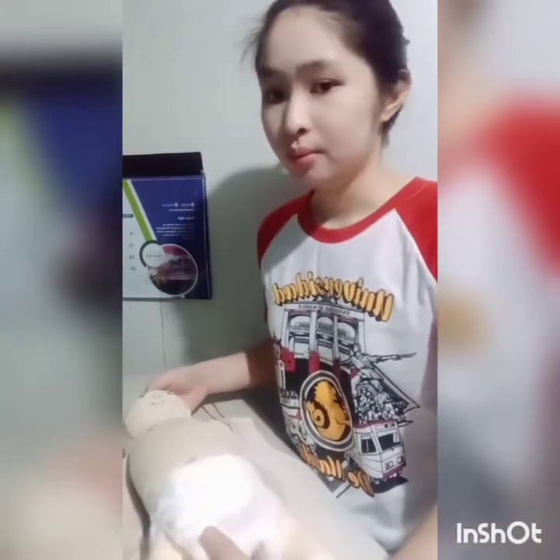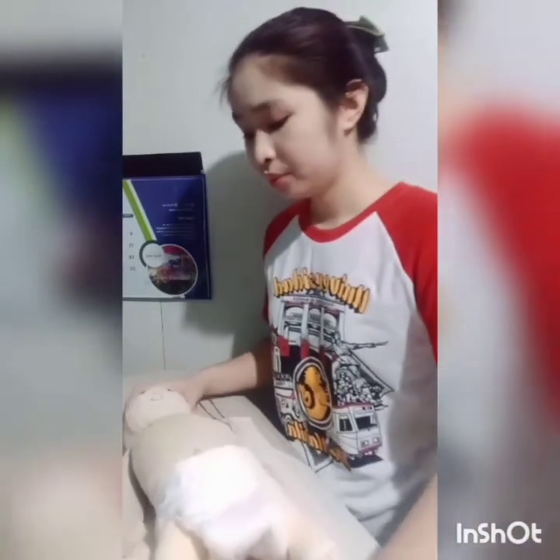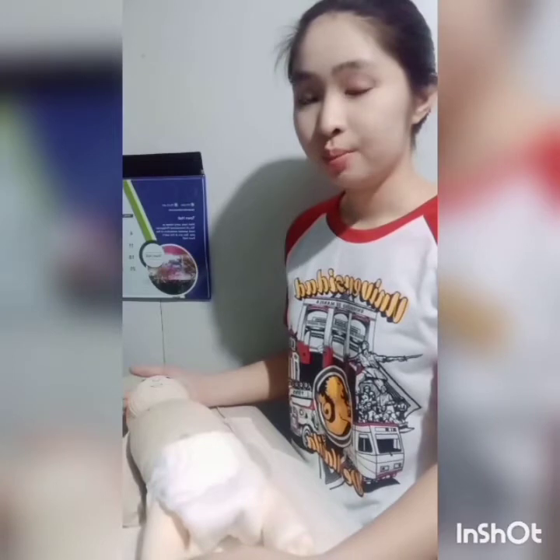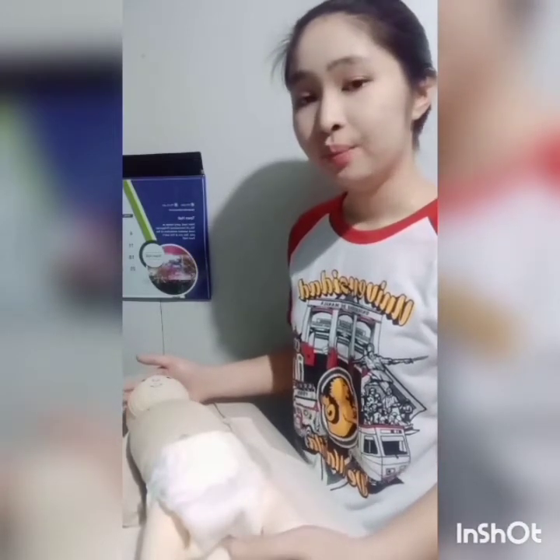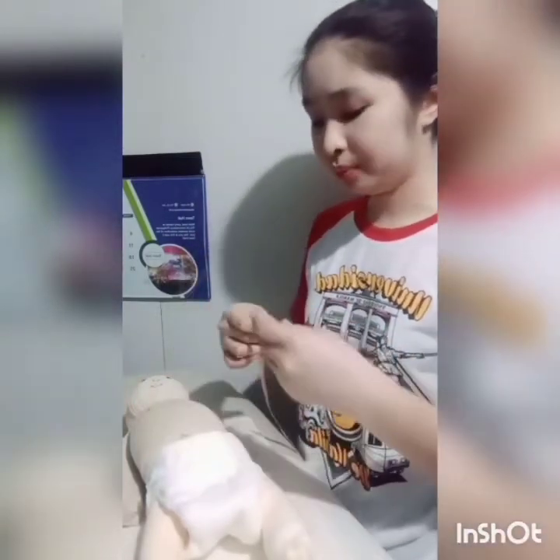For today, I am going to perform the measurement of the baby's length alone. It is advisable to let the baby calm first before proceeding with the measurement for us to have an accurate measurement, whereas the baby is in a stable manner.